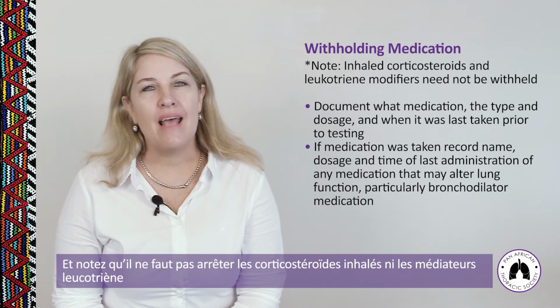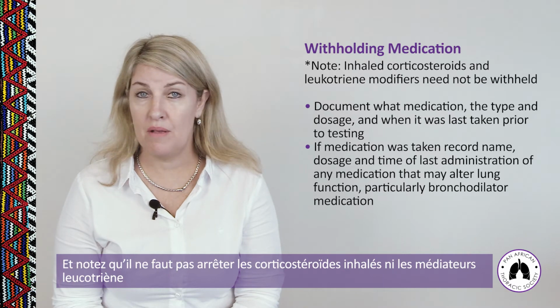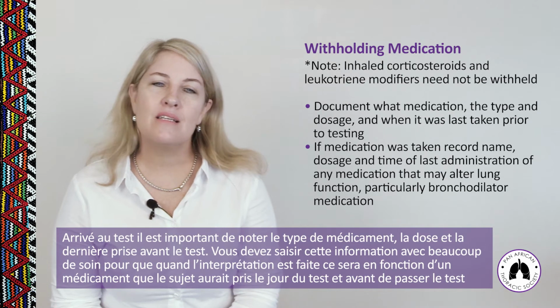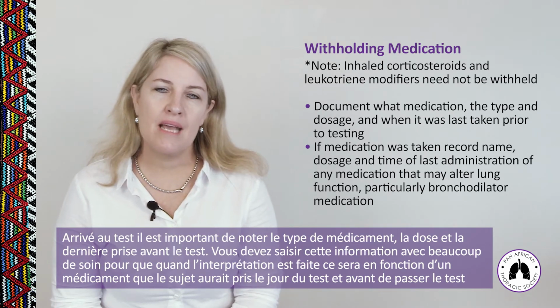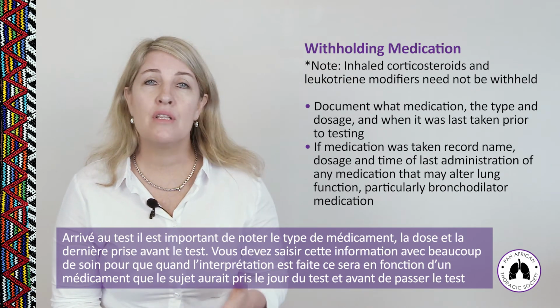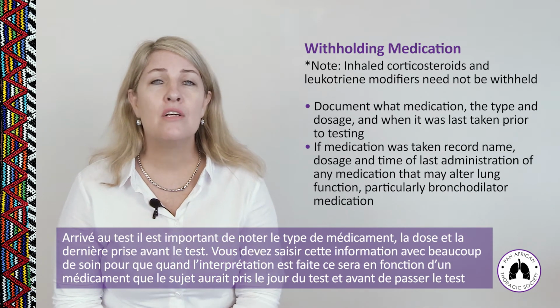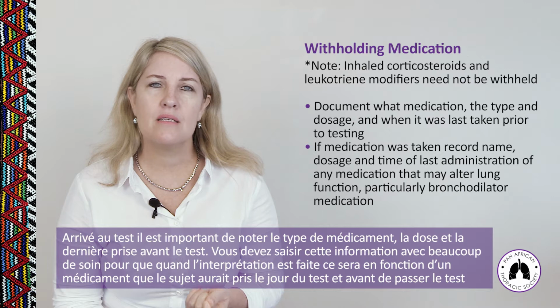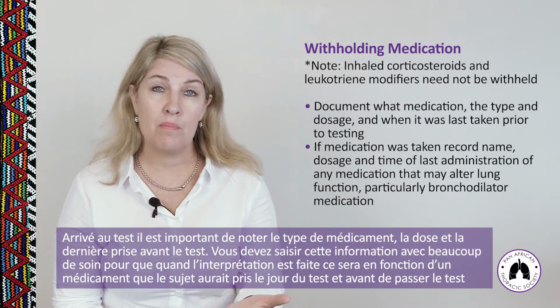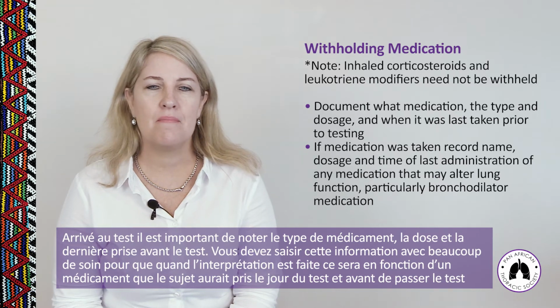And please note that inhaled corticosteroids and leukotriene modifiers need not be withheld. At the test, it's important that you document what medication, the type, the dosage, and when it was last taken prior to the testing. You need to make sure that you document that very carefully so that the person interpreting the test does so understanding what medications the person might have taken on the day prior to testing.